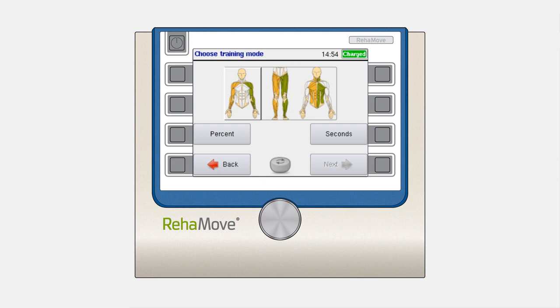In the next step, you have to choose between percent and second mode. To do this, use the third button on the right or the third button on the left. Your choice will be marked in green.